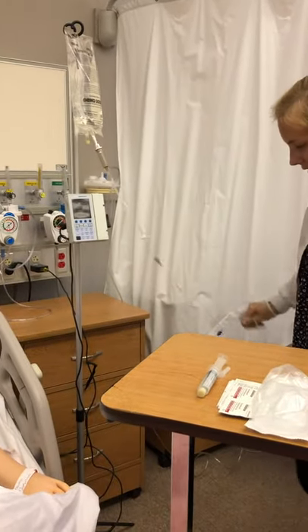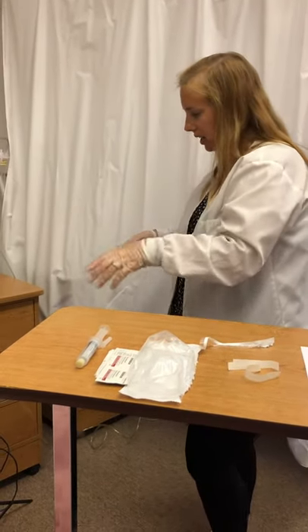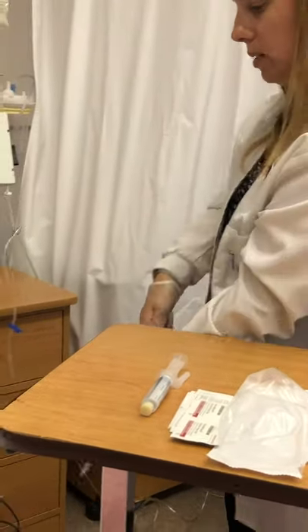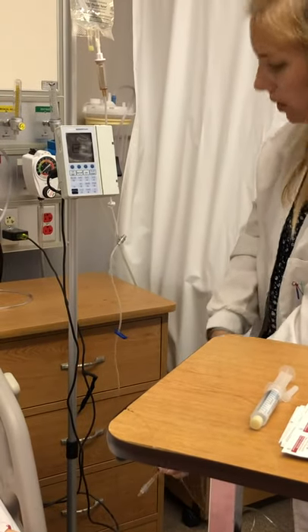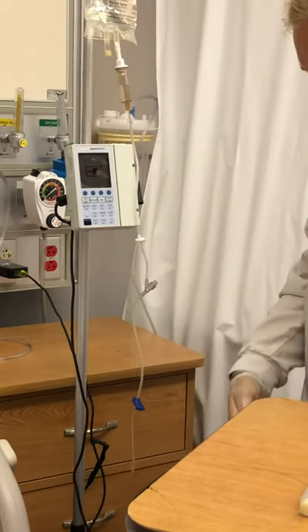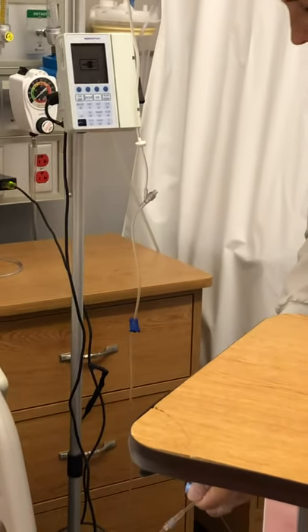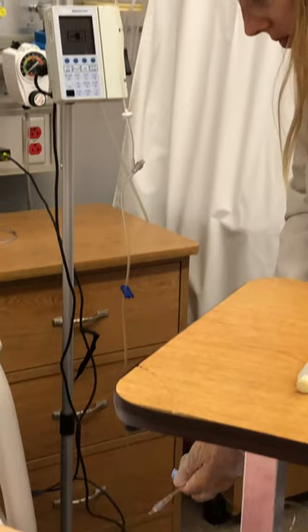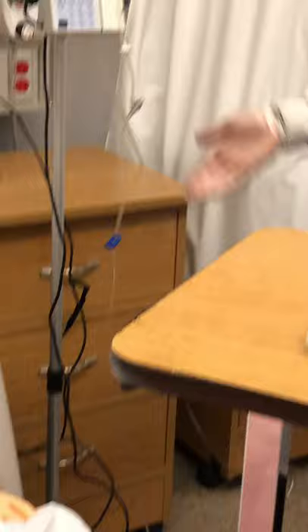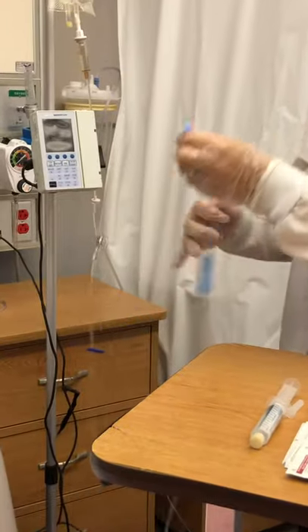I'll untangle the tubing and then slowly take the cap off and prime the tubing into my trash barrel to get all the air out. Don't forget to squeeze your drip chamber until it's about half full. I'm just going to slowly get all of the air out. Perfect — that's primed, I don't see any bubbles, so that looks great. I'm going to replace my cap so I don't contaminate the end.